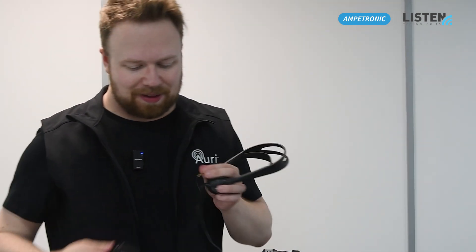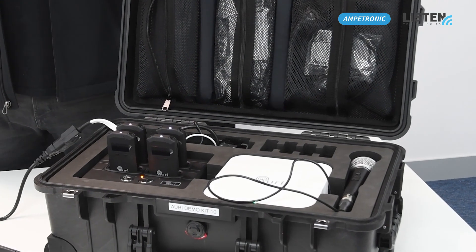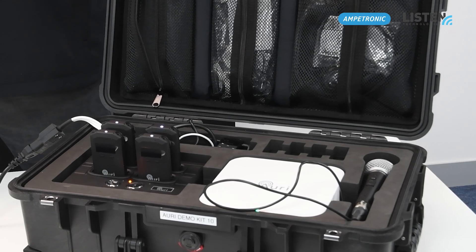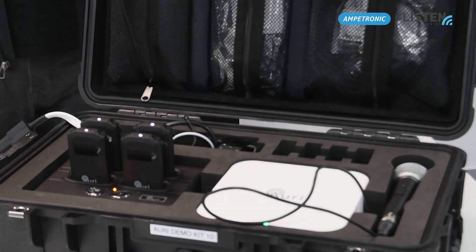Once I'm done demonstrating, I'll simply unplug the headphones, place it back into the dock, and there you have it — the brand new Auri demo kit. Auri: AuraCast technology from Ampetronic and Listen Technologies.